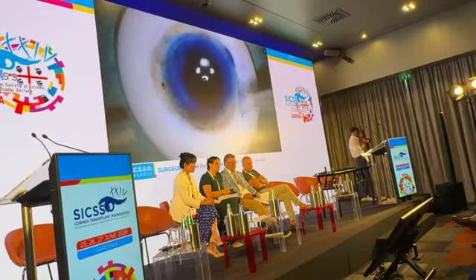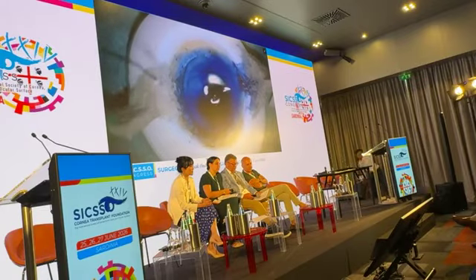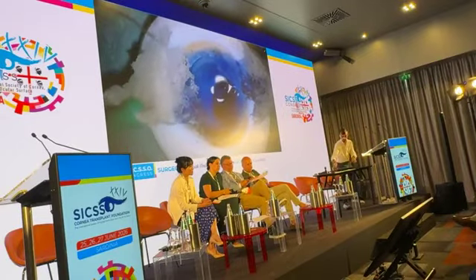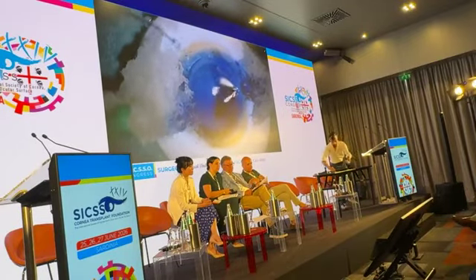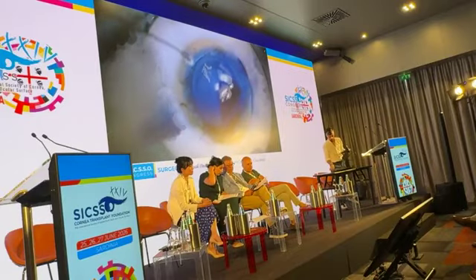Also, you have seen briefly in the first phases, because Dr. Bezek was very quick in the first capsulorhexis, that the diseased endothelium was initially stained with trypan blue in the recipient. He does not perform this procedure every time. However, to enhance the visibility of the diseased endothelium, he sometimes uses the trypan blue just to highlight it before performing the descemetorhexis.